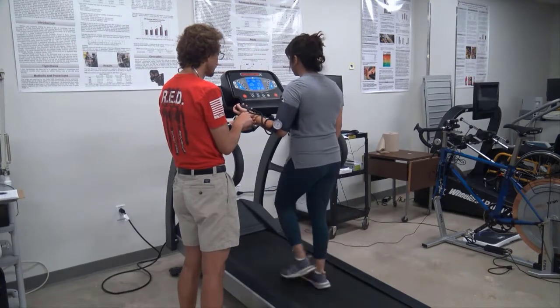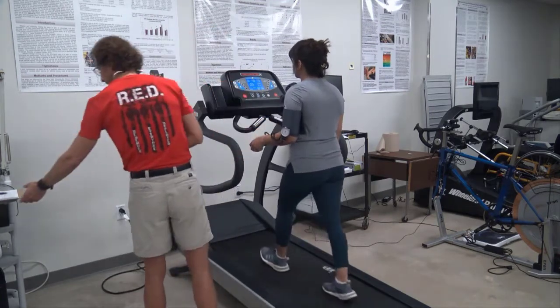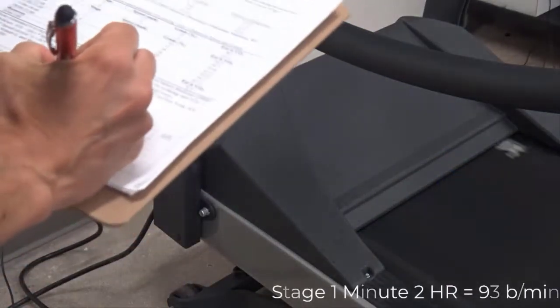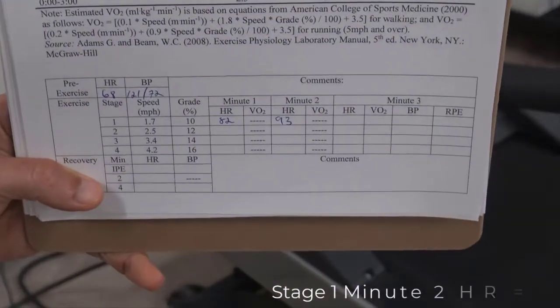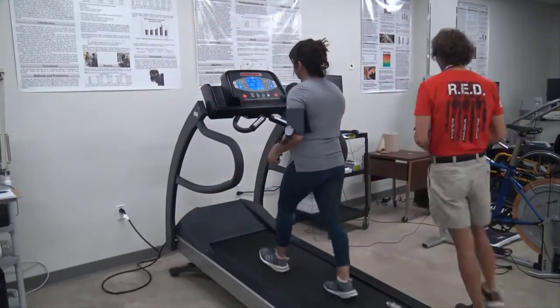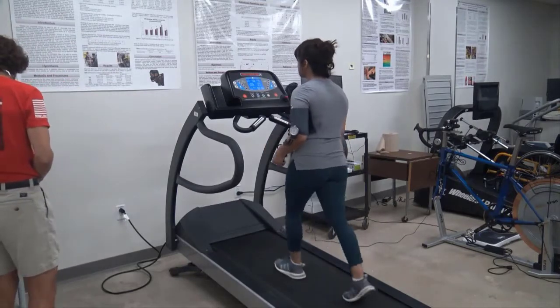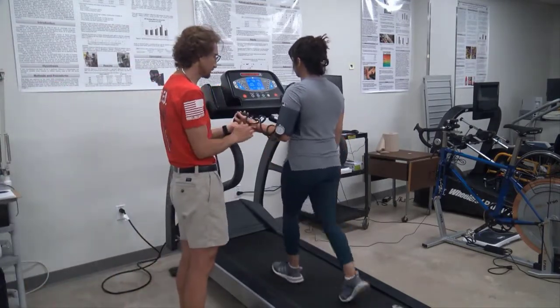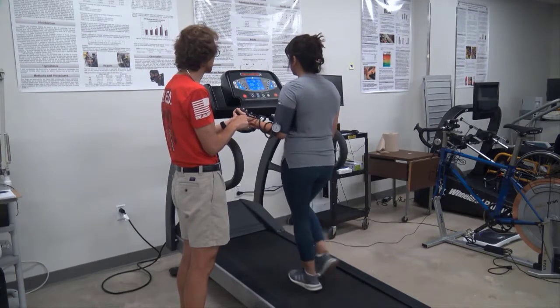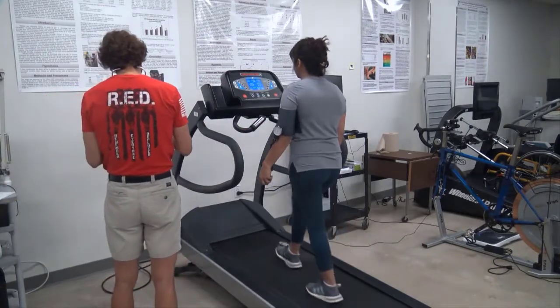Take the 2-minute heart rate in the same way as the first minute — the arm is being supported, and record your pulse count on your data sheet. Here we see heart rate was 82 in the first minute and 93 in the second minute. The last minute of each stage is the busiest because of the additional measures of blood pressure and RPE, and you must also decide if the client is in steady state or if a fourth minute is required, and whether they need to proceed to the next stage. Make sure you have your RPE scale ready, but remember to take the heart rate first — heart rate always takes precedence over blood pressure.